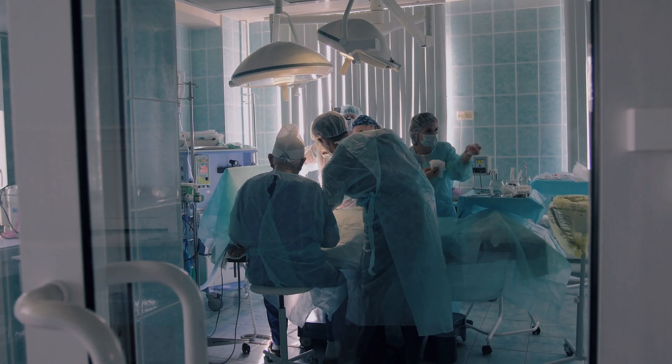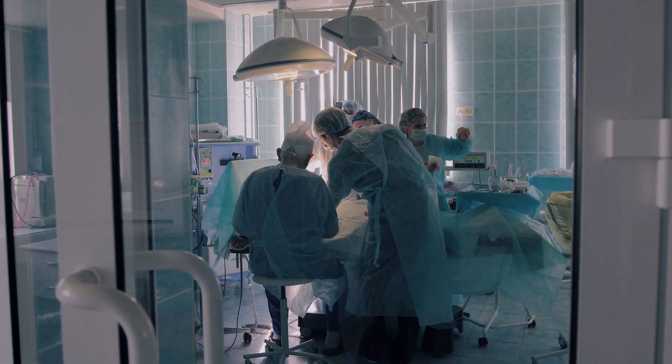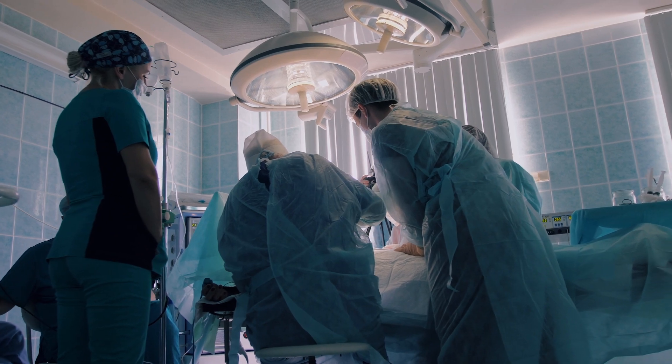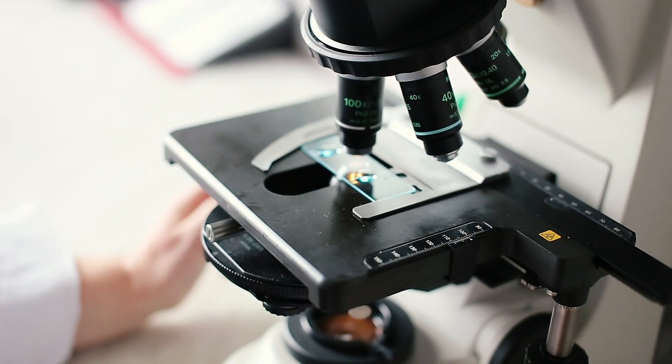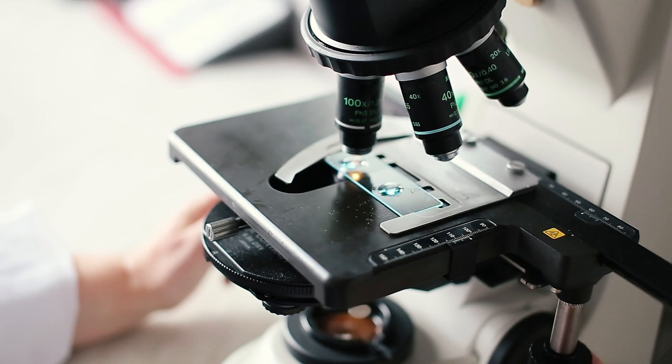When a patient goes through surgery, the main goal of the surgery is to remove all the cancer cells in the patient. But in order to do that, you have to basically look at the tumor under a microscope.